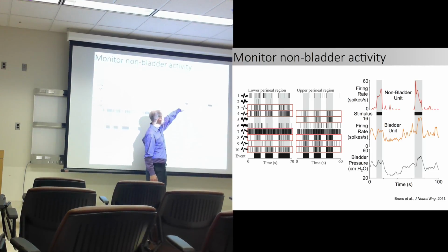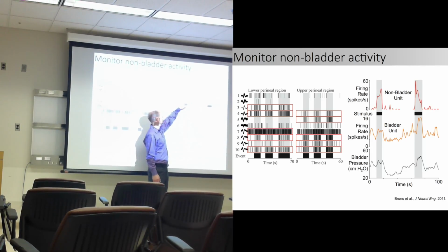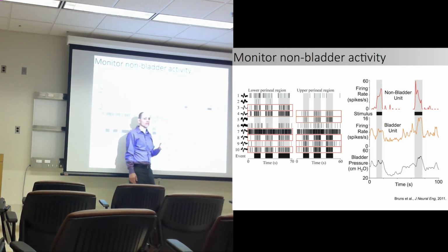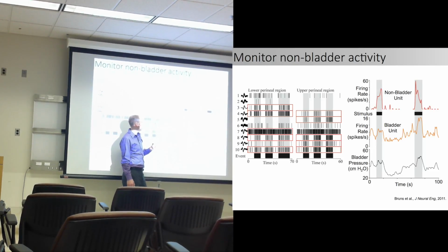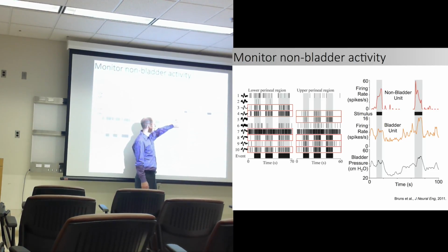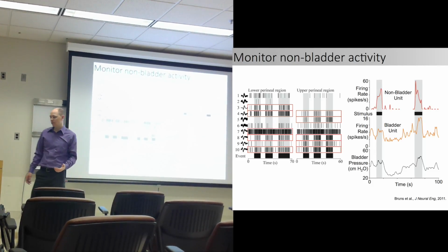That sensory stimulation drove a lot of general nerve afferents that fire very fast, with a lot of action potentials in response to that, probably a somewhat nociceptive stimulus. So if there was a non-specific nerve recording, perhaps reporting all the activity in a whole fiber bundle, it would be visible during a bladder contraction. Because we have a selective neural interface, we're able to differentiate between non-bladder units and bladder units, potentially lowering the possibility of false positives.